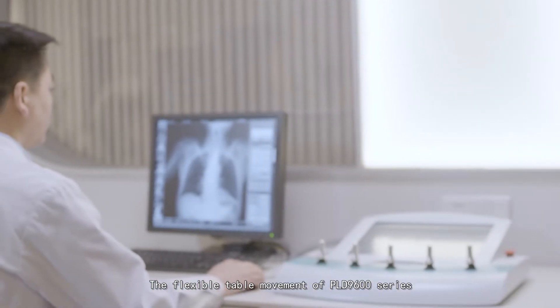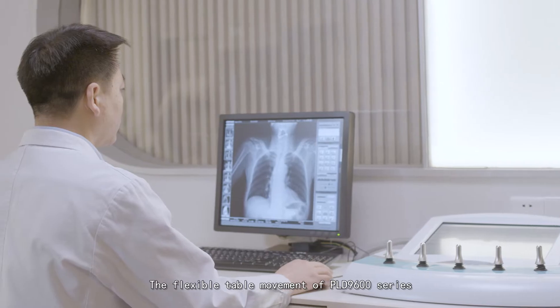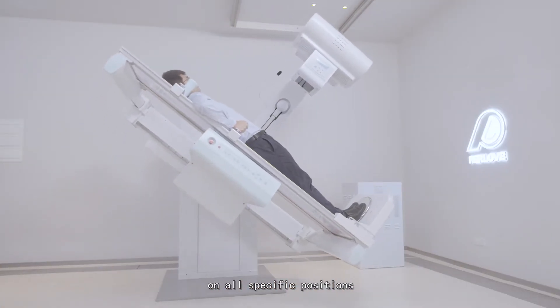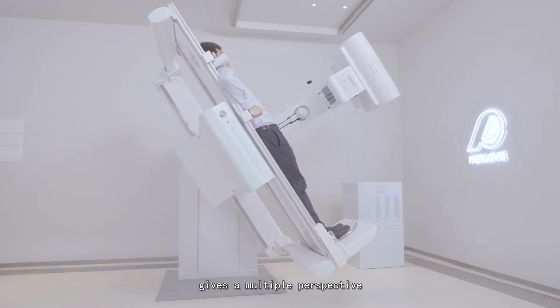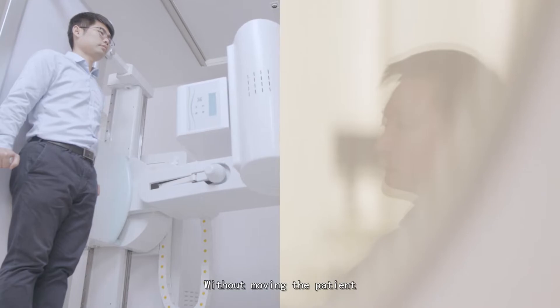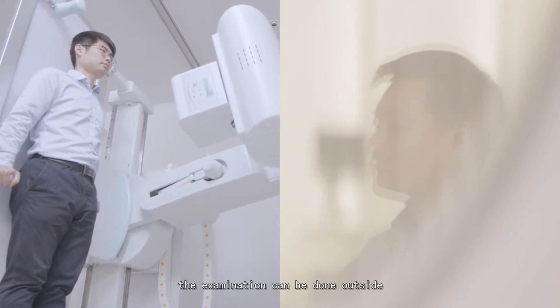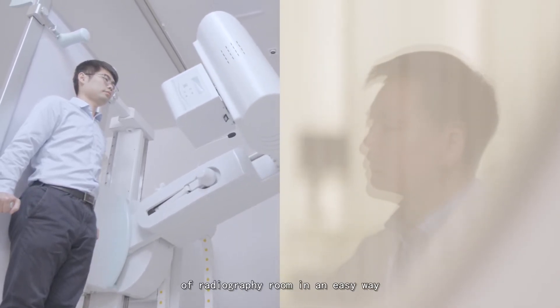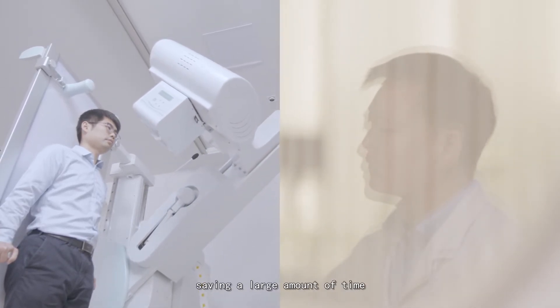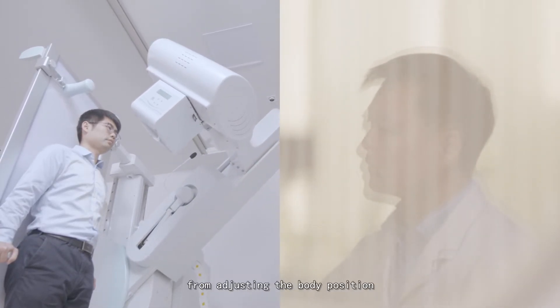The flexible table movement of PLD9600 series easily meets the clinical diagnosis demand on all specific positions, giving multiple perspectives for radiography and fluoroscopy diagnosis. Without moving the patient, the examination can be done outside of the radiography room in an easy way, saving a large amount of time from adjusting the body position.